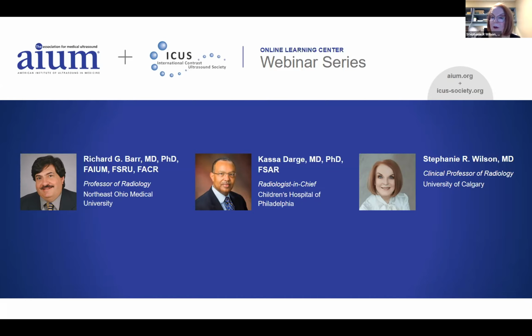So, Kassa, you answer about the children. Yeah, you mentioned it. Those of us who do pediatric MR know the struggle with the motion artifact and how much anesthesia and sedation we use to reduce that. Actually, the blessing of contrast ultrasound is you can do it under motion. We don't ask the patient to hold their breath. We do it while they are breathing. You can move with the transducer and follow the lesion. So that's really a great possibility of contrast ultrasound.